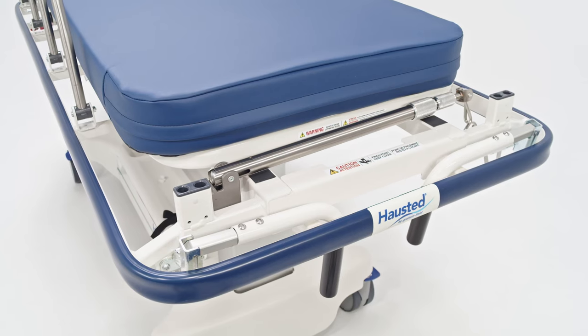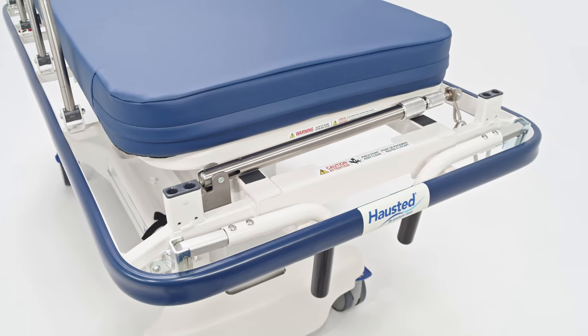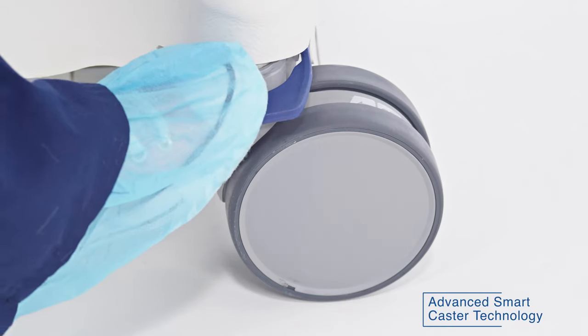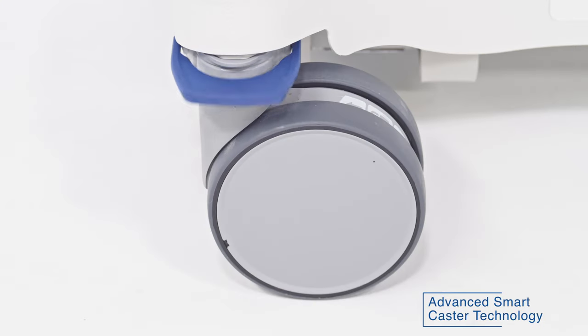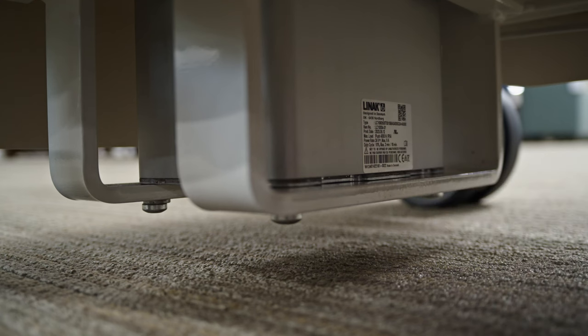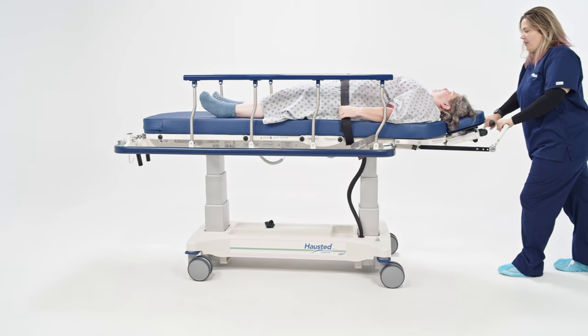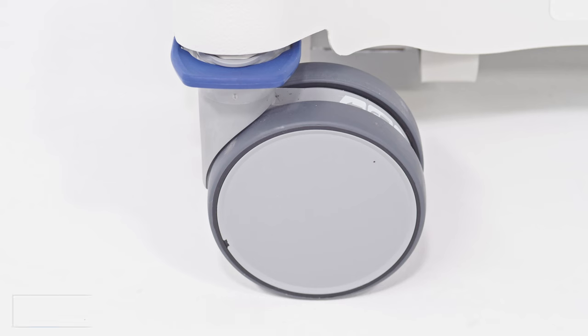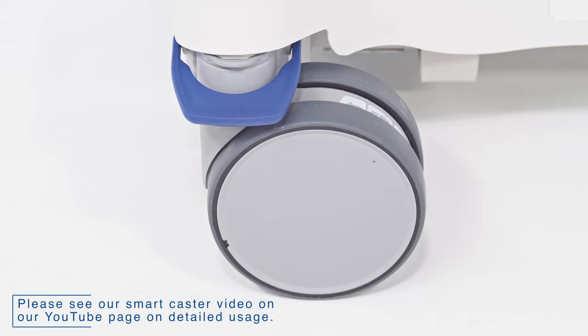The 5E82 EYEST offers some of the most exciting features built with the most advanced technology available today. Advanced Smartcaster technology with electric braking and advanced steering system, intuitive pendant, and lithium battery comes standard on the unit. This system makes steering and braking easy and safe for staff and patients. To enhance patient safety, the system will automatically lock after 30 seconds of non-movement.